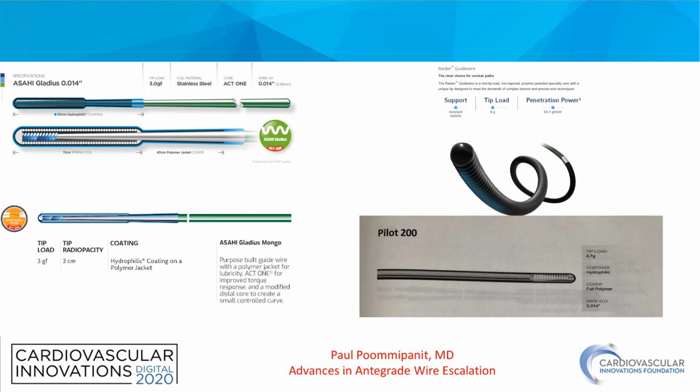The next group of wires in my mind are the intermediate polymer jacketed wires, with the prototypical wire being the Pilot 200. There have been advances in this space as well, with technology improving steerability, as well as other factors such as penetration power, and in the case of the Gladius Mongo wire, the ability to prolapse the wire into the subintimal space.